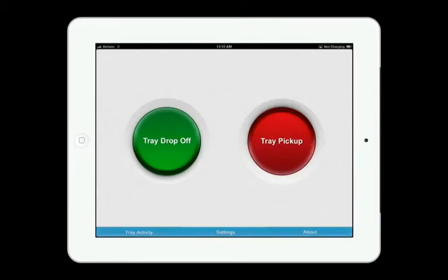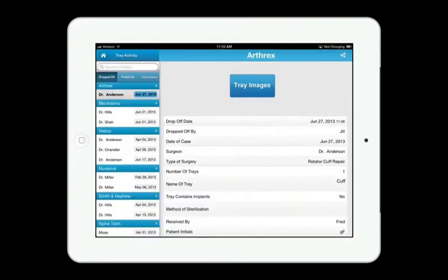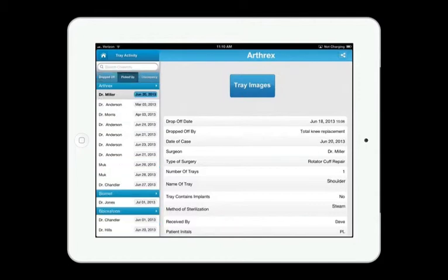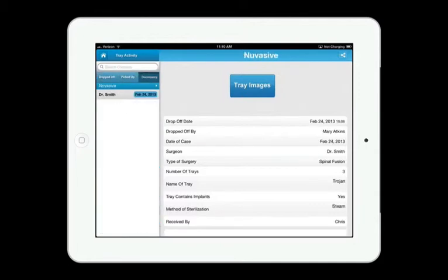Now you can access all your loaner tray activity by hitting the Tray Activity button on the home screen. You can see the trays that have been dropped off, the trays that have been picked up, and the trays that have been picked up with a discrepancy.